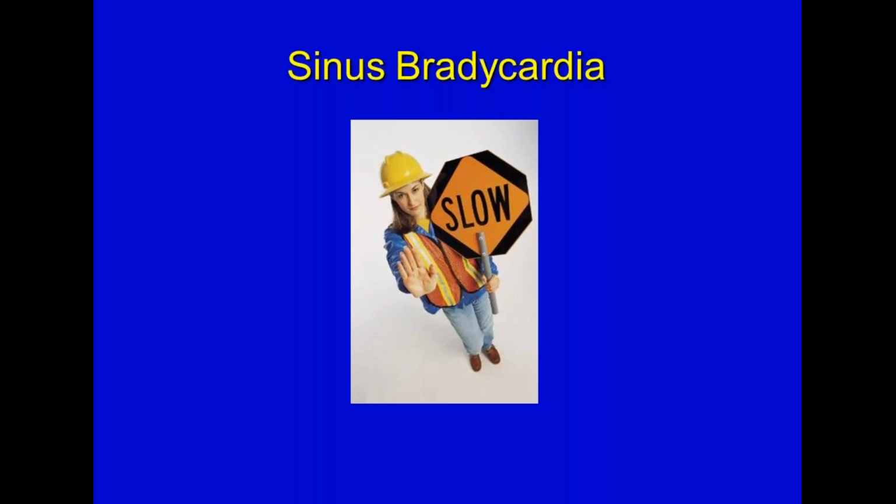So by definition, what's bradycardia? 60 and below. So of all our other characteristics, let's make this really simple here. All our other characteristics for sinus rhythm are going to be what we just saw on this previous slide. In a bradycardic rhythm, what would be different?